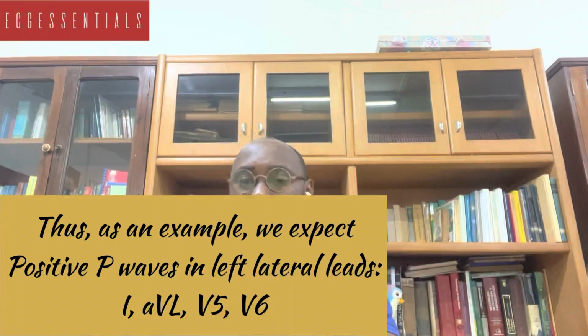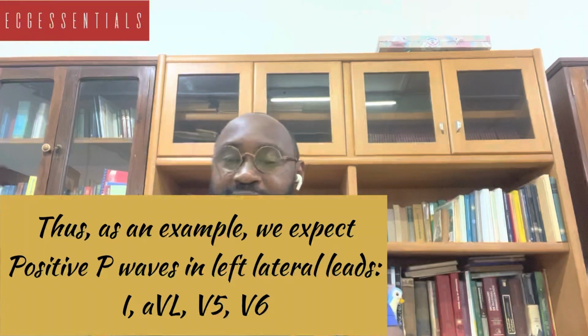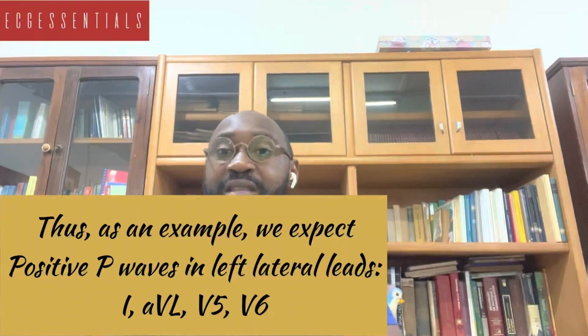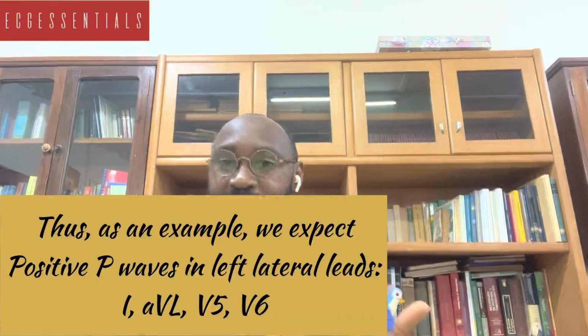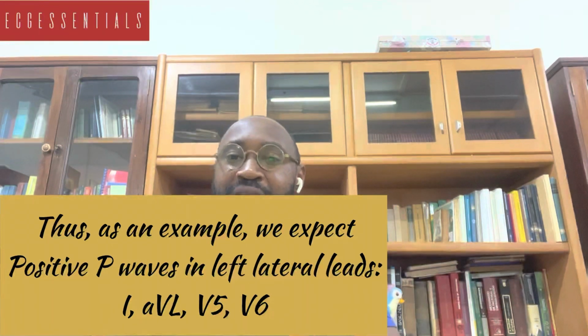They are within or close to the angle of orientation of the P wave that we have said is between 0 and 70 degrees. So we expect that in these leads, the P wave will be positive. And similarly, in AVF that assumes 90 degrees, it's also close enough to the 70 degrees, so we expect that the P wave will also be upright.